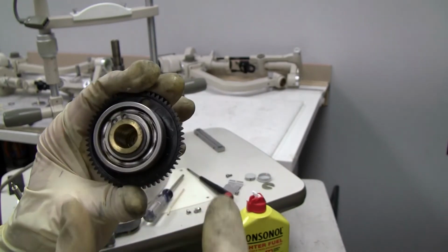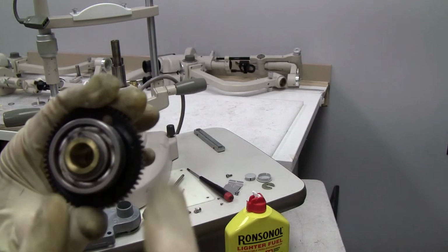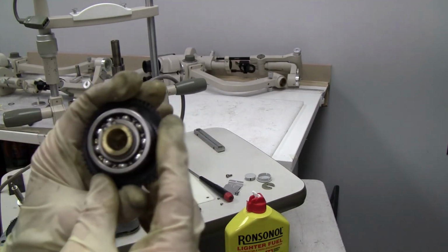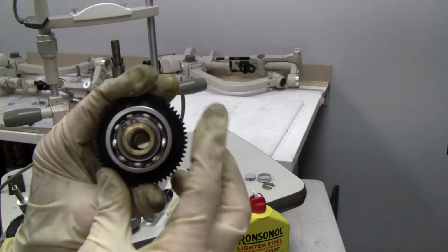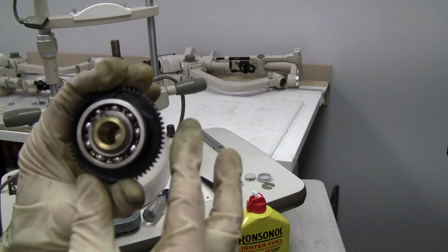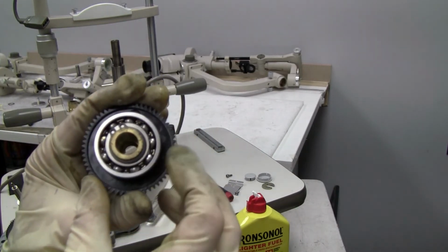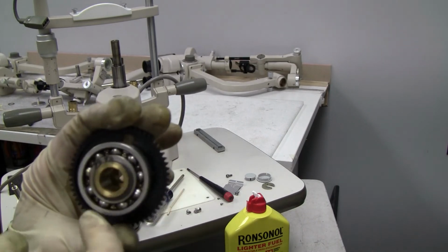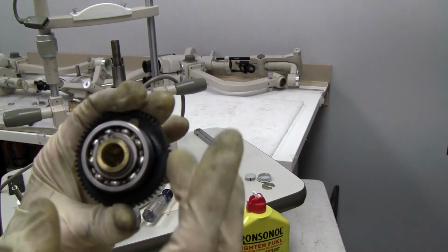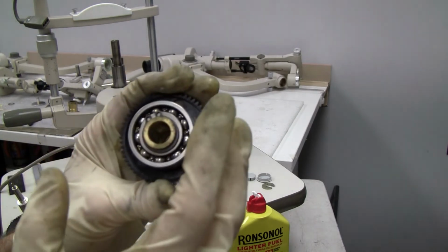But not too much, because if they're too free, then they're going to be noisy. And if they're noisy when you turn them, then you're going to have to put some more grease back in there to quiet them up. So it's a little delicate. It's a delicate balance of grease and lubricant to make your bearings turn and also to be quiet.